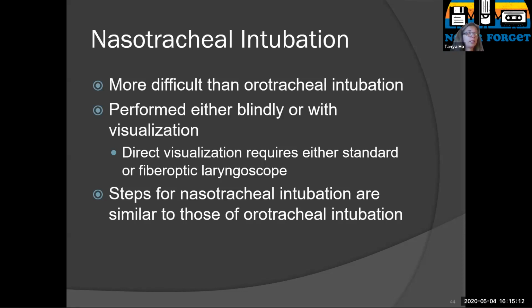And why would we do nasotracheal intubation? Well, generally in the event that the oral route is not available, like if a person has trauma to their airway, or maybe they're going to have a big facial surgery or some kind of oral trauma, some kind of surgery done on their face, on their mouth, then you'll want to go with the nasotracheal route. Usually this is done for short term, because we don't want to keep things through the nose since people develop sinus infections. So ideally this is a short-term solution.